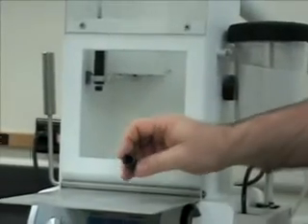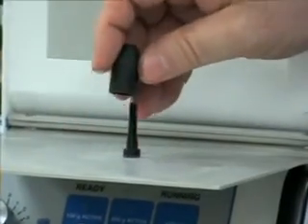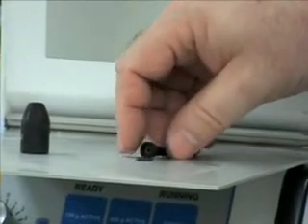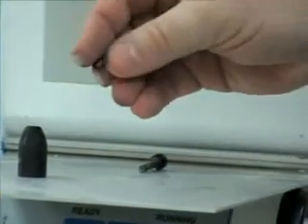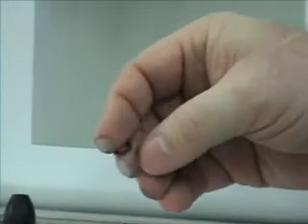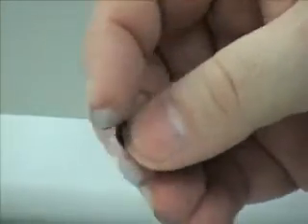Now I'm going to tip it over and tap it lightly, and actually just go ahead and drop the nozzle out. But the thing I want to stress here is that you don't want to lose this little O-ring in the tip of the unit. This again can become caked with beads or very fine dust, and it's a critical seal area in the unit.